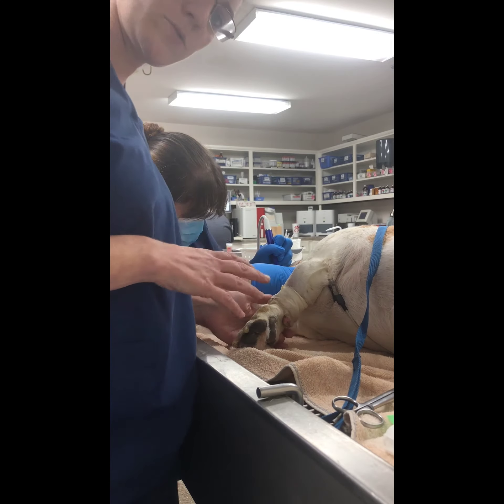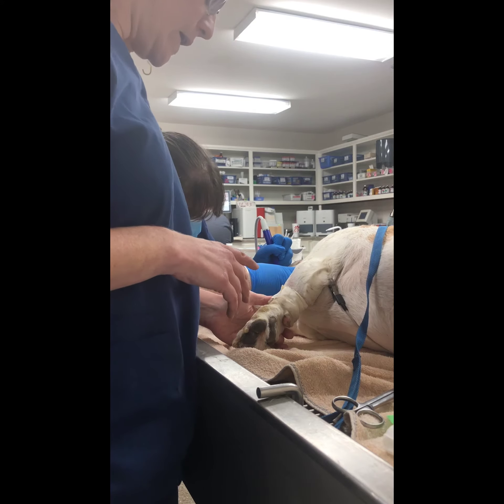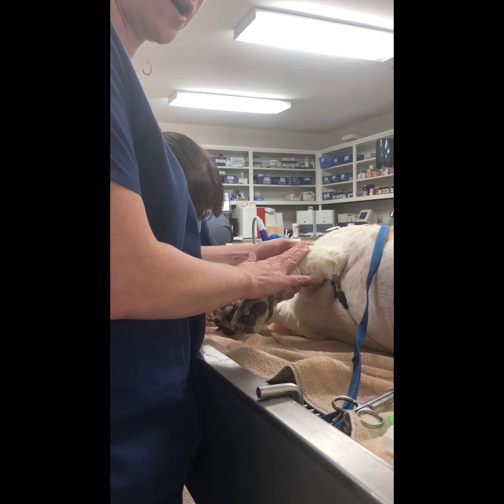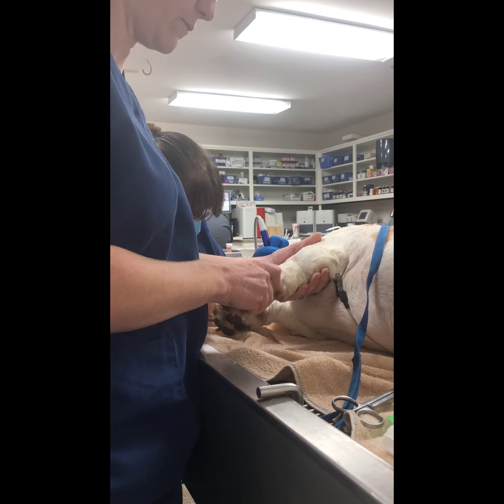So this is Roscoe. We actually found out that this catheter is blown — it's not flowing properly.